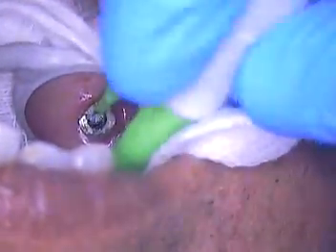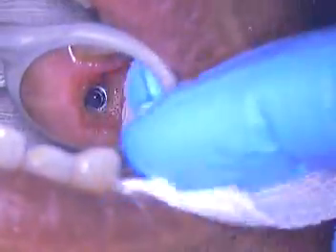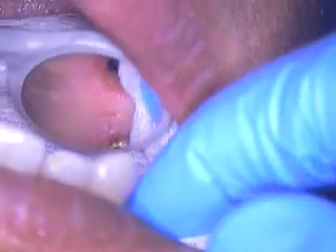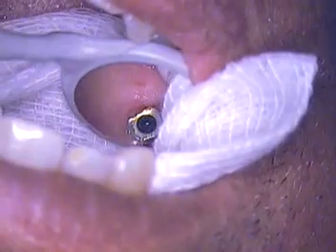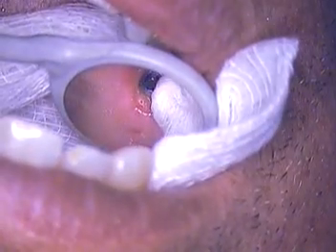Another larger diameter — I can tell you, we're going right down to the base. This one's definitely got more. Back in with more solution. I'm going to put a little bit more TNS solution in there and let it soak. The old saying is trust your brain, not your eyes — you want to make sure that you give it plenty of time to penetrate. We'll clean up the rest and make sure the threads are meticulously pristine before he's on his way back to his dentist.